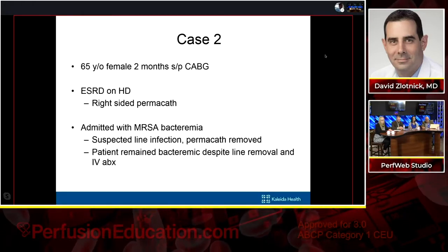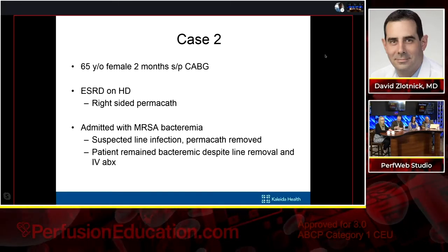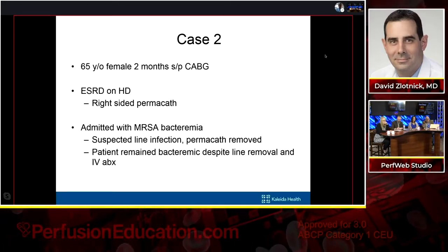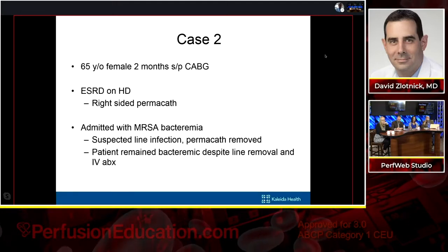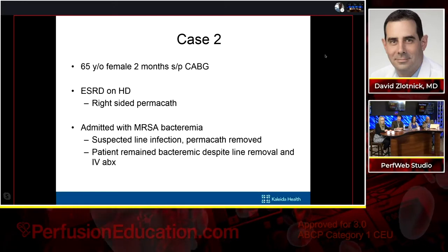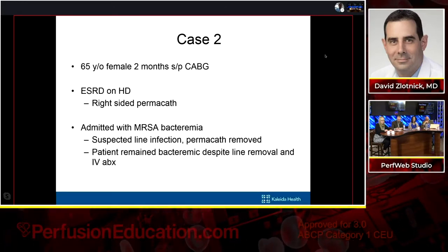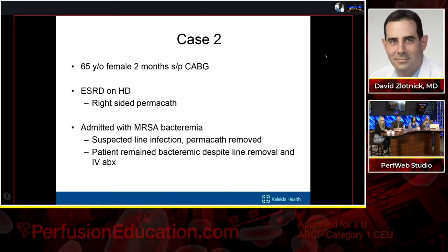So continuing on with the thrombectomy theme, the second case is a 65-year-old female who's 2 months after bypass surgery. She has end-stage renal disease and is on dialysis. After bypass surgery, she was discharged with a right-side permacath for dialysis access. Well, she got admitted with MRSA bacteremia.